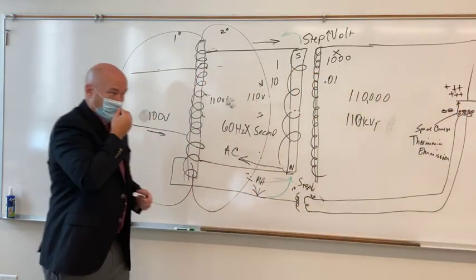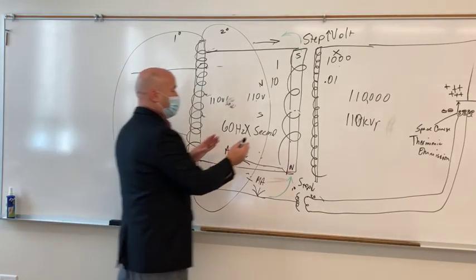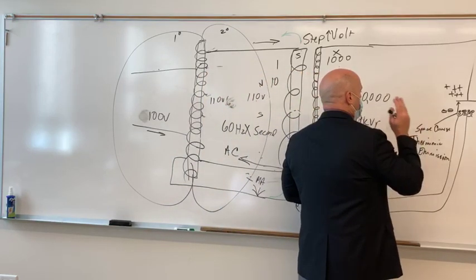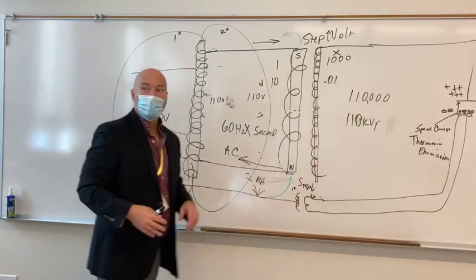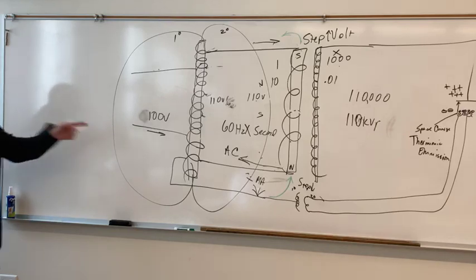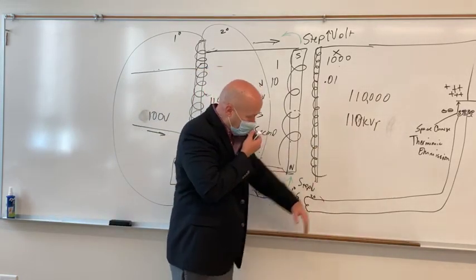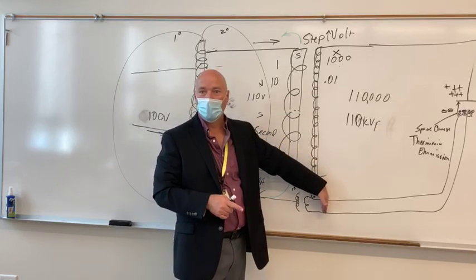Okay? So, alternating current, gotta have it. We're going to learn that by the time we get to this point, we don't want alternating current anymore. So that's really kind of in the next stage. But all the way up to this point right here, we have to have alternating current. Why?